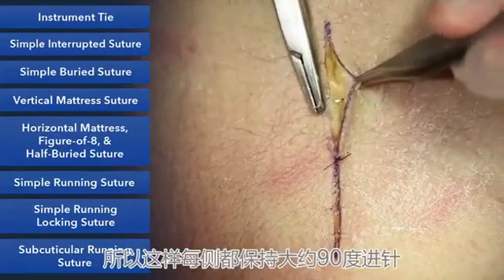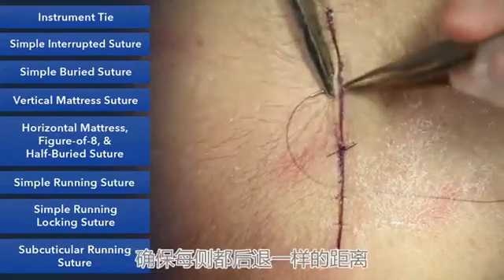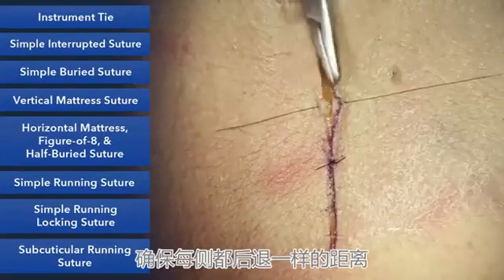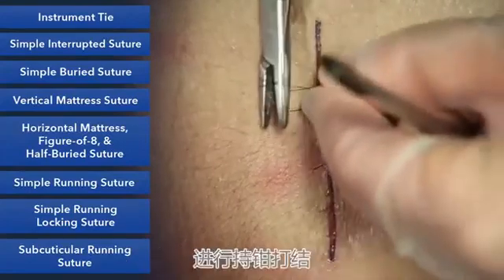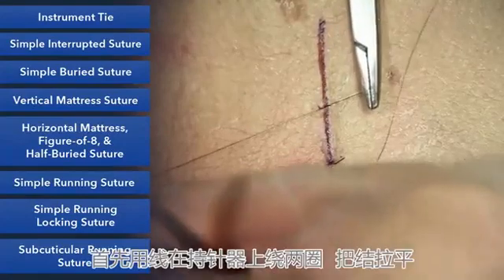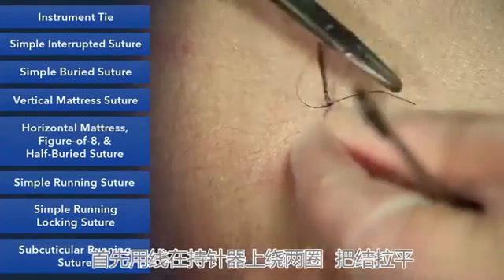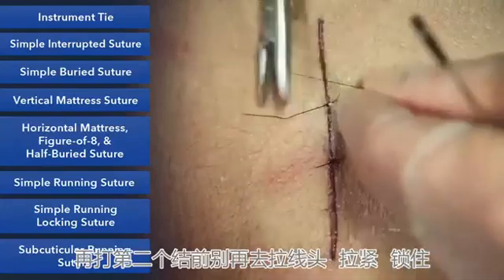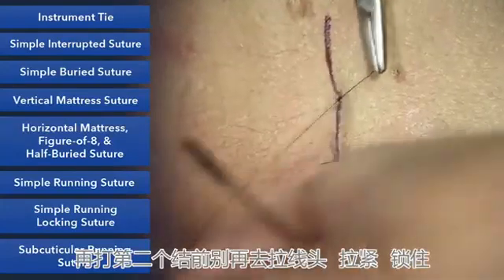So here again, exaggerate the 90 degrees on each side. Make sure that we are back the same distance on each side. An instrument tie, we do a surgeon's knot for the first. We cross the suture over, lay it down nice and flat. Don't pull up on it until we get the second suture down and tighten it and lock it in.